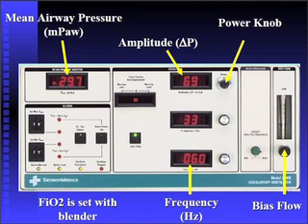Another thing I want to point out is that there is not a peep level here, that the mean replaces the peep, and that it is more than a normal peep. The next setting you have on is the amplitude. You'll turn this knob in the circle until you achieve the reading that you want. Some practitioners have set this amplitude reading or power at 20 above whatever their last CO2 was.